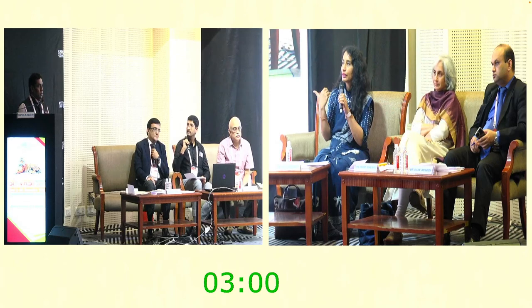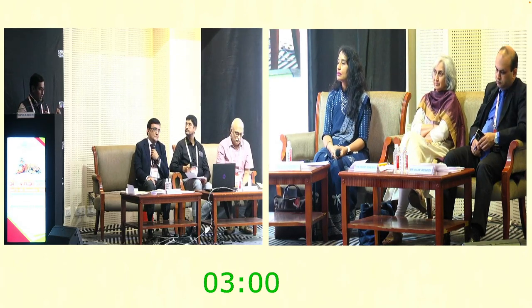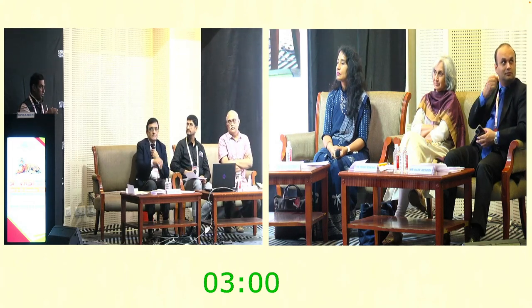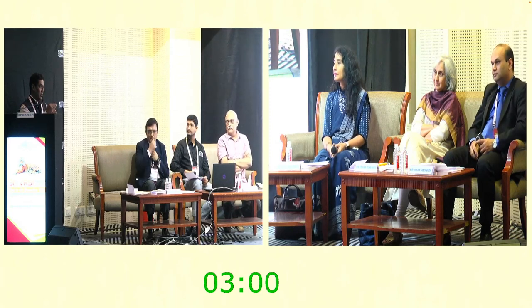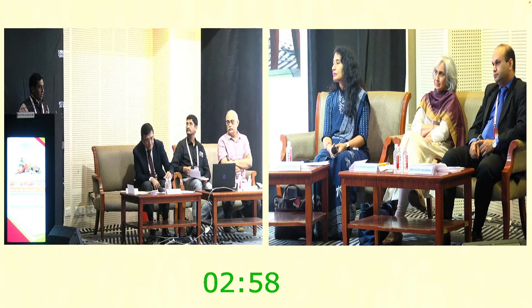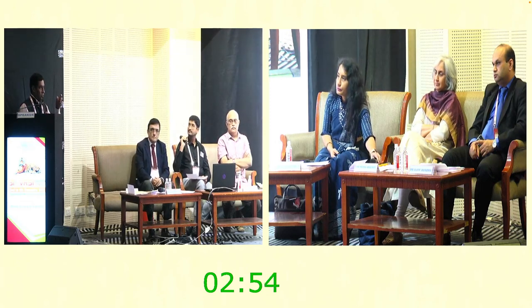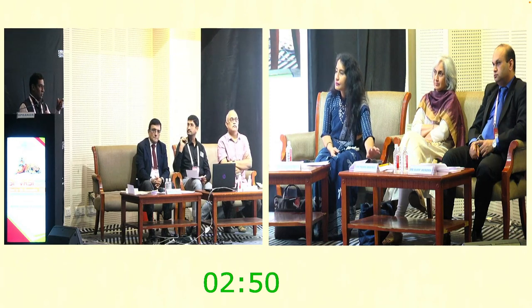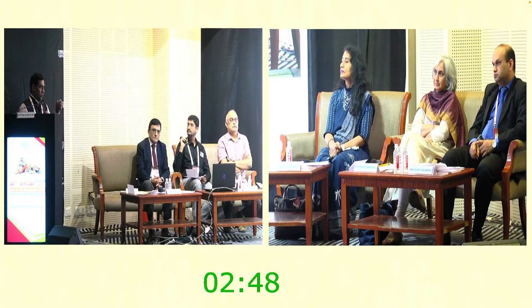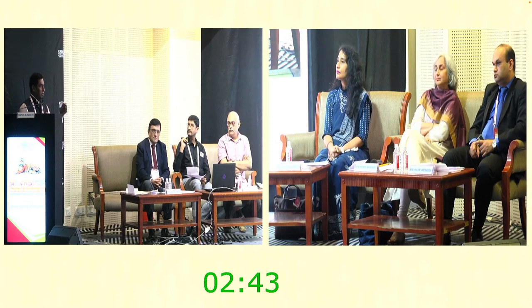Egress, was there any? You should obtain a little dimpling while you are before injecting, so that your sclera is actually acting as a guard. Most of the time it does not regress, and the amount should be very carefully gauged. Just like I told, it has to be exactly 0.01 or a little more to take care of the dead space in the needle.